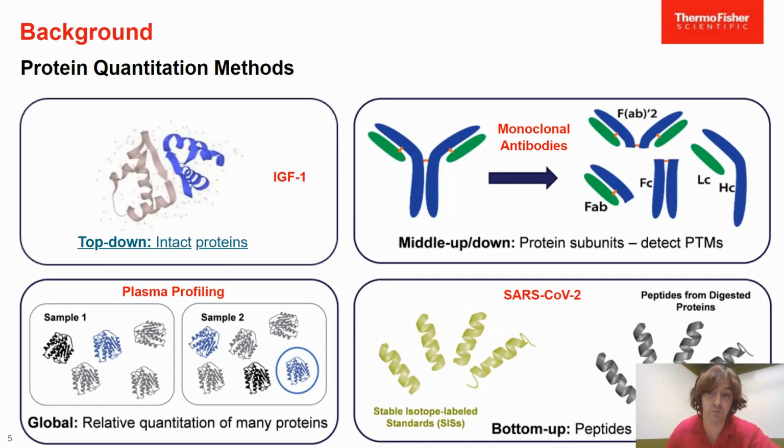Individual peptides from wild-type proteins or variants can easily be targeted using bottom-up mass spectrometry. In addition, heavy isotopes corresponding to the targeted peptides can be spiked into the samples and act as internal standards. This increases the certainty of our results, as well as allowing correction for matrix effects and for more accurate quantitation.